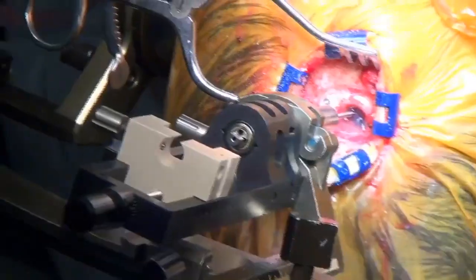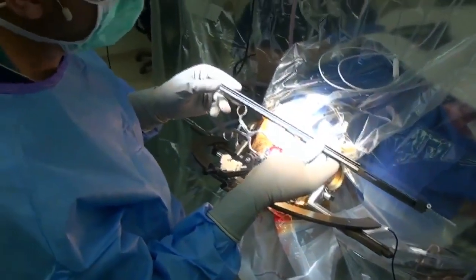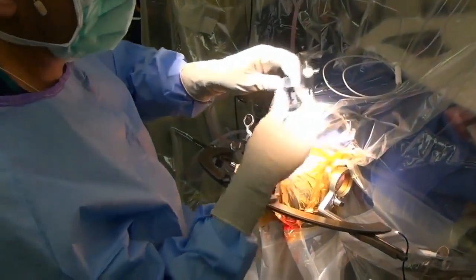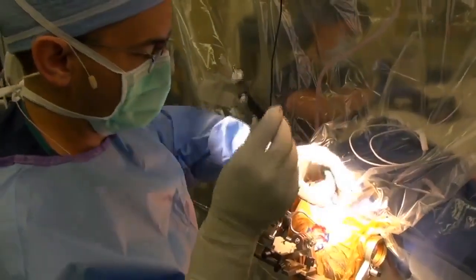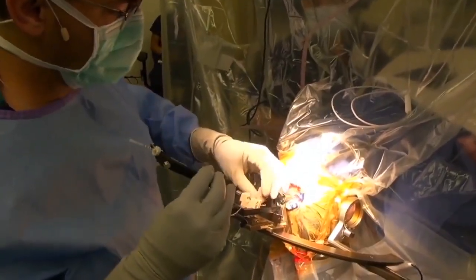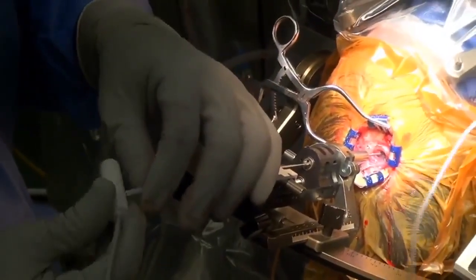And so we're at our target now, and this is the DBS electrode right here. You can see here, this has 4 little contacts. They span 10.5 millimeters right at the tip. So this measuring device, Sylvia set this up for me. It looks good. I double checked it. And this is measured so that it'll stop right where it needs to stop. And a lot of this is knowing how all these parts fit together, kind of knowing it like the back of one's hand.